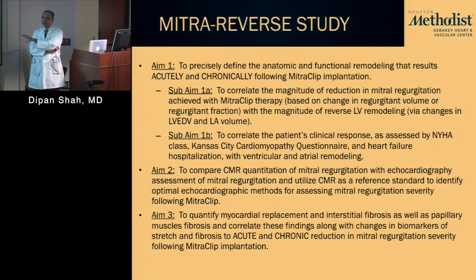So really, it's hard to do this technique with small animals at this point. Now, again, this was a few years ago when we looked at it, and I don't know if there's been further evolution in that. Most of the sites that had done some of these small animal studies basically had a physicist on site that could do pulse sequence development, that would actually program these pulse sequences. So that's been one of the challenges.